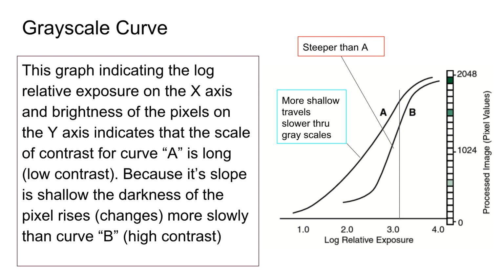If you create a steep slope, that's going to represent itself on the image as being a short scale, high contrast image. If you adjust the S-curve, you don't really see this, especially when you're moving it around, but imagine that even if you don't have this S-curve, it's happening in the background.